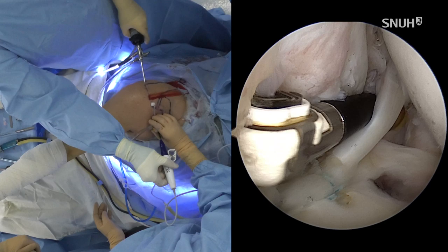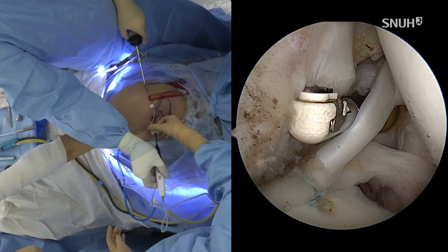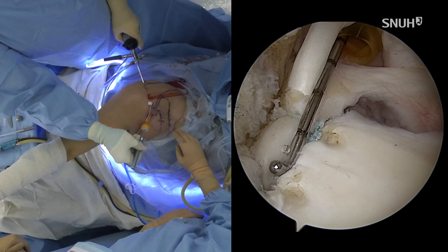So there is a little bit of partial tear in the supraspinatus. I like to just debride it to treat the mechanical symptoms of the supraspinatus. Here I can check that the superior labrum is well fixed to the superior glenoid tubercle. So I like it.